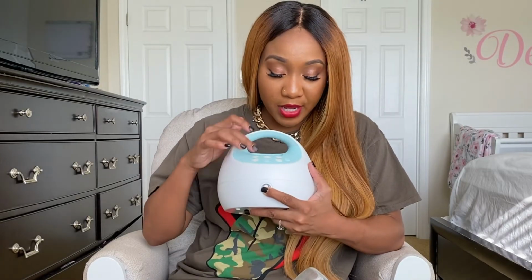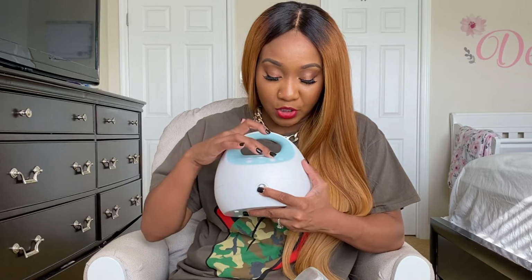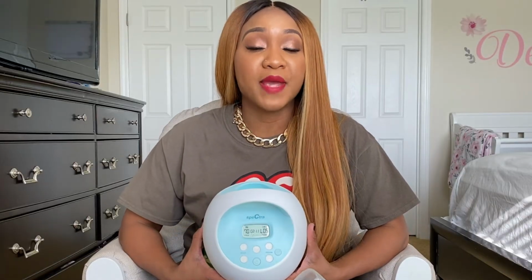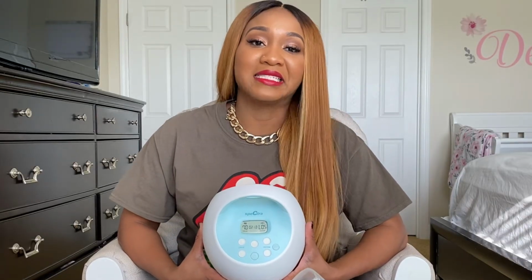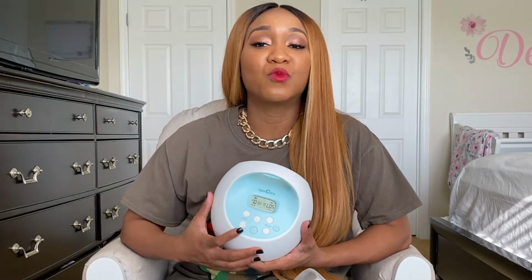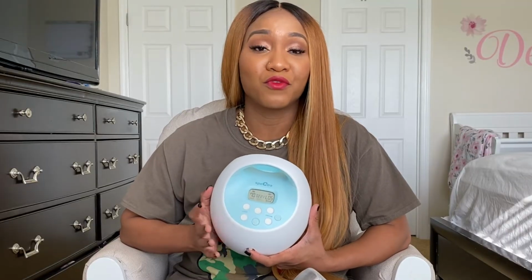Now, when I first started pumping, big mistake, I would pump in this mode the entire time. You can't change the cycle, but you can change the level. It goes from 1 all the way up to 5. I would start off on like 2 and then bring it up to 5 and pump for like 30 minutes on this cycle. And that is a no. The reason I did it is because your breasts are so sore in the beginning, and that was comfortable for me. But don't make that mistake.